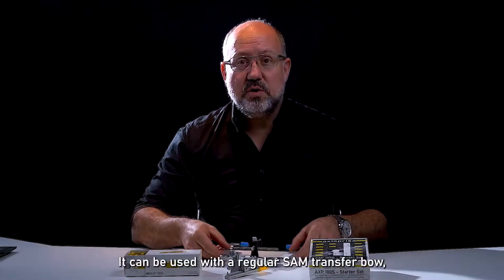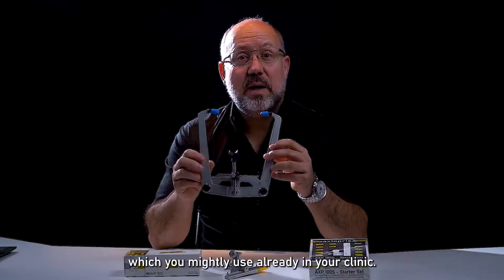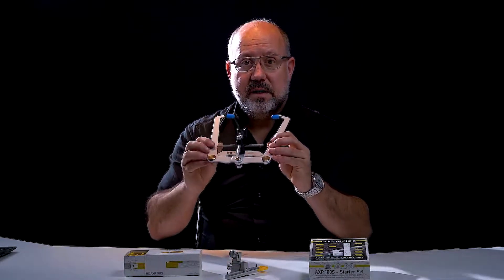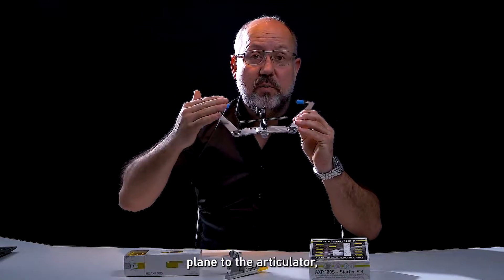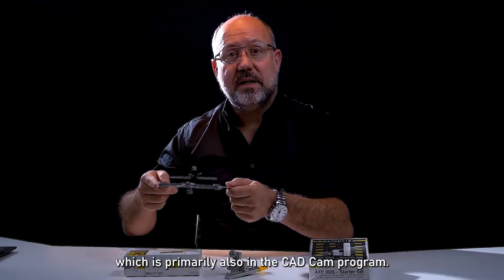It can be used with a regular SAM transfer bow, which you might use already in your clinic. It's used to orientate the patient's axial orbital plane or Frankfurt plane to the articulator, which is primarily also in the CAD-CAM program.